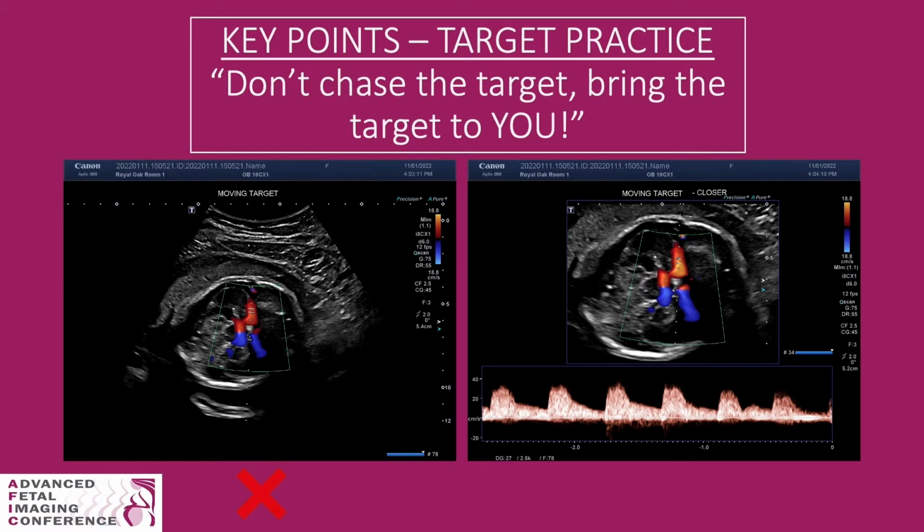I see this time and time again when I visit sites or go in to help with a scan. Many sonographers will struggle for several minutes trying to obtain a waveform or a sample of a structure or even clearing up a 2D structure. The biggest reason for this is due to image optimization, or rather a lack of. Often the structure or target is so far away or so small or displays insufficient color fill, etc., making it almost impossible to obtain a clear image or accurate sample.